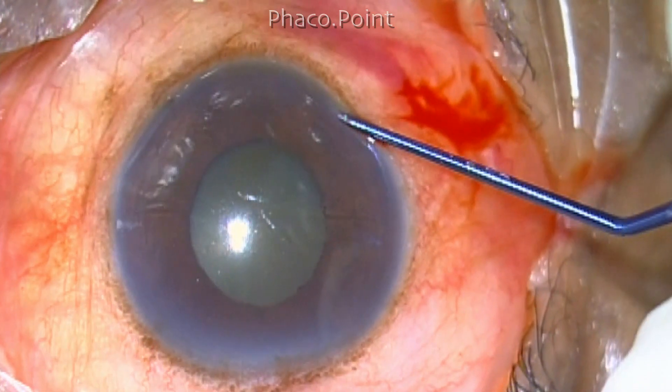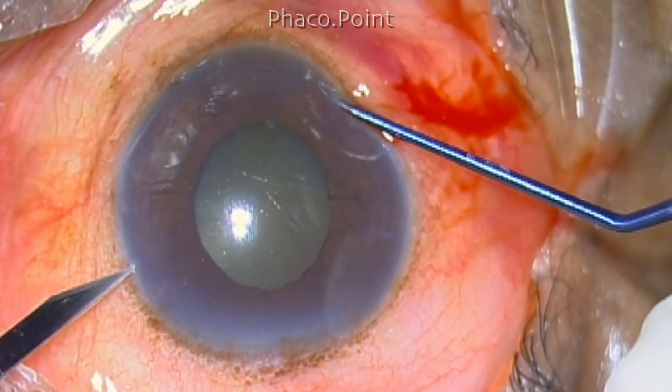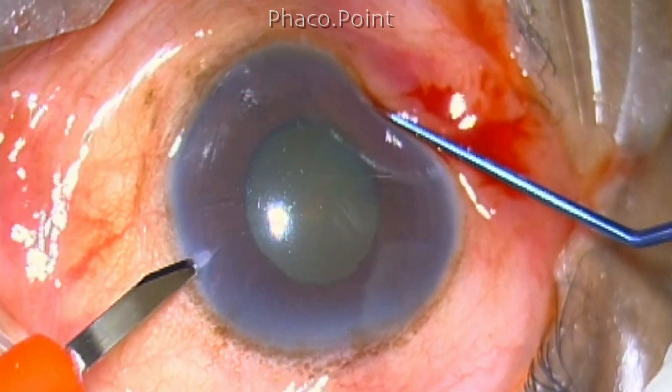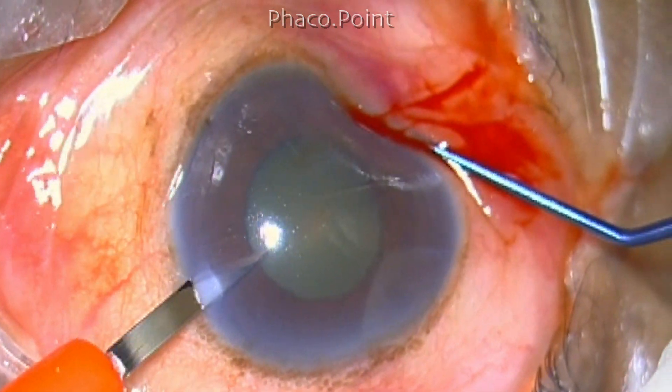You can get away with subconjunctival anesthesia — it works really well and is equivalent to topical phaco, except that there is a higher chance of getting a subconjunctival hemorrhage.